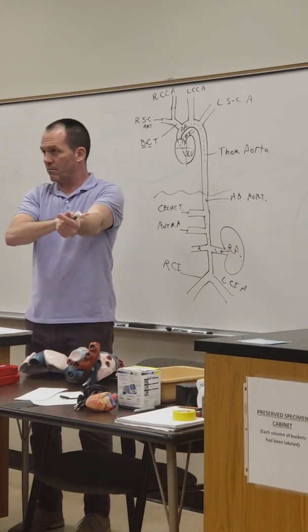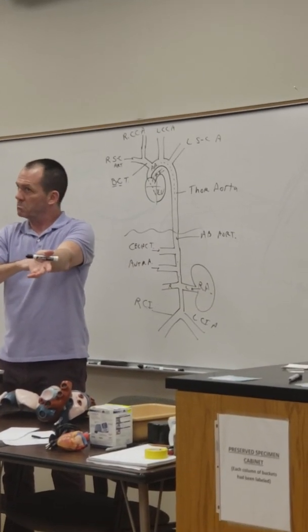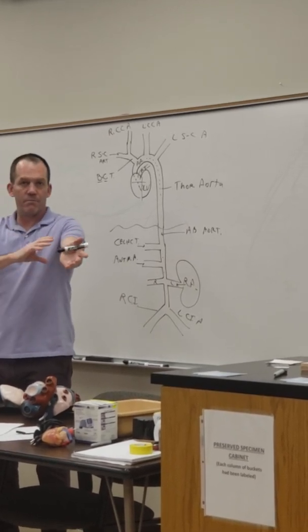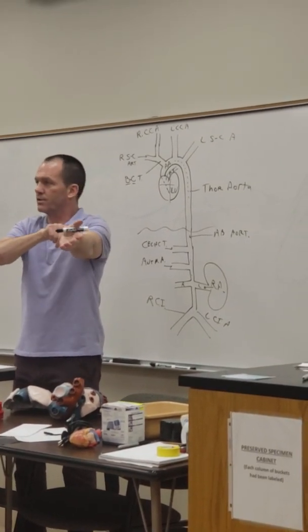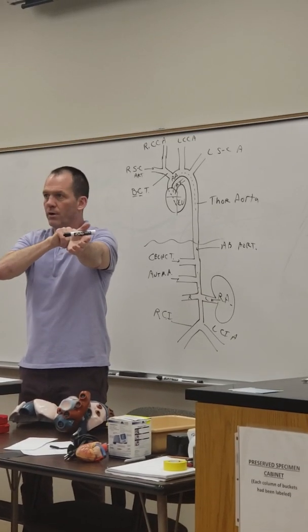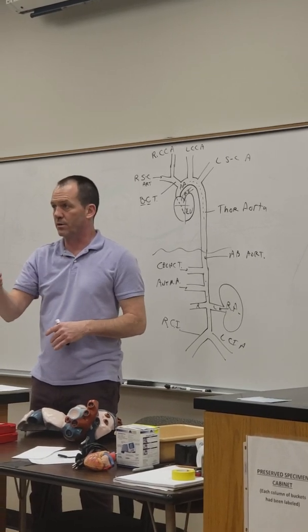You don't hear anything downstream. Just discomfort for the person with 170 millimeters of mercury around their arm. Then the cuff loosens, and pretty soon systolic pressure is enough to squirt through. I start hearing that noise, and that's the first sound of Korotkov. That's where you measure systolic pressure.